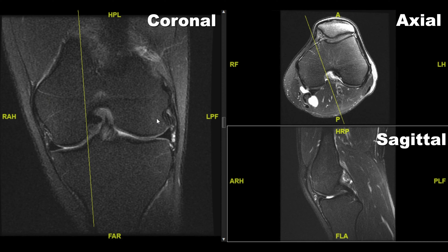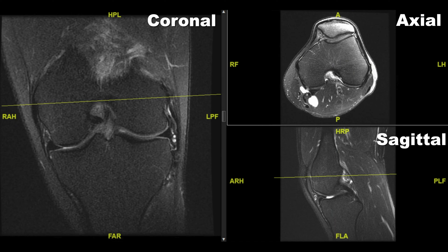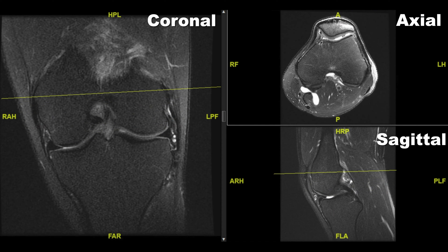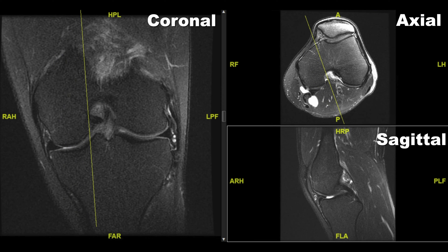What we've got pulled up here is an actual knee MRI scan, and if you'll notice there are three windows here. Each one of these windows represents a different perspective on this knee MRI. You can see how I can scroll through each window, each set of images. That's really what the MRI is — it's a set of cross-sectional images through a structure.